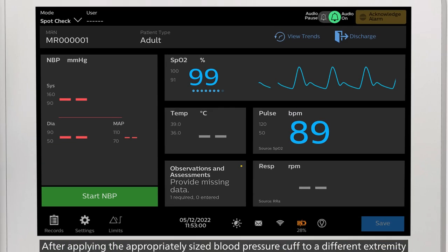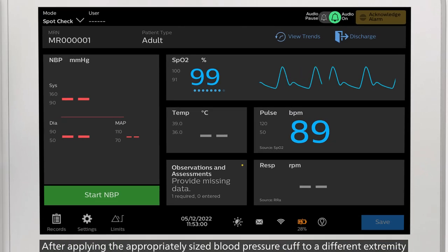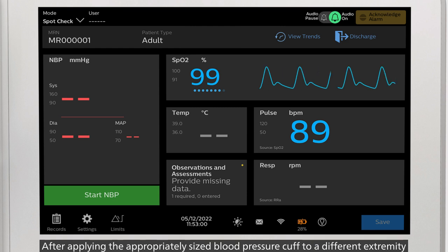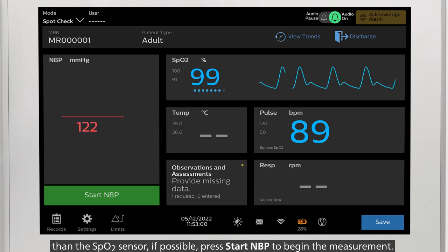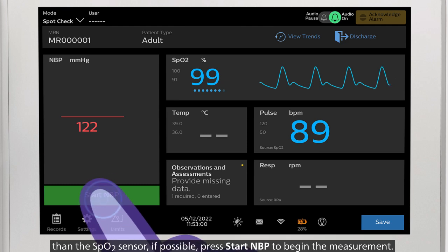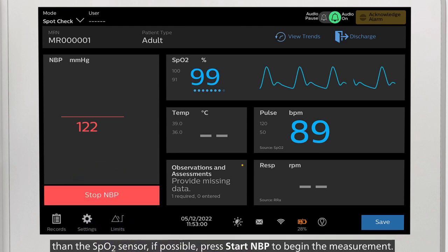After applying the appropriately sized blood pressure cuff to a different extremity than the SpO2 sensor, if possible, press Start NBP to begin the measurement.